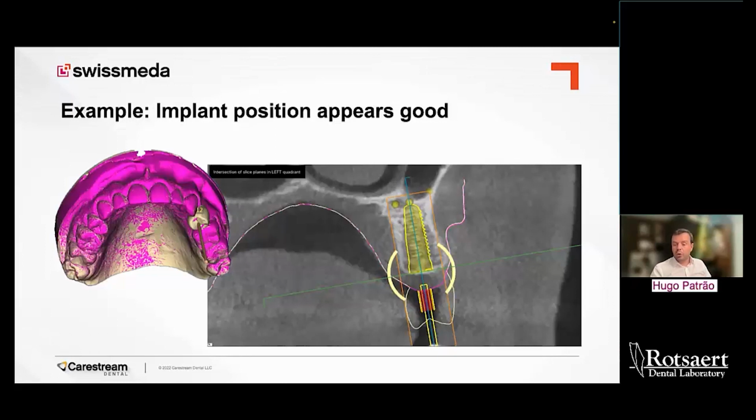Another thing that we want to avoid is aesthetic errors. Okay, what I mean by that, if you look at this case, and if you have not been on the 3D implant course before, you might look at this implant and say, yep, straightforward. Premolar there, plenty of space, a lot of bone, nice healthy bone. Even the crest of the bone is flat, so leave the implant as it is, and it will osseointegrate perfectly. And you are right. That implant is perfectly placed inside of the bone.